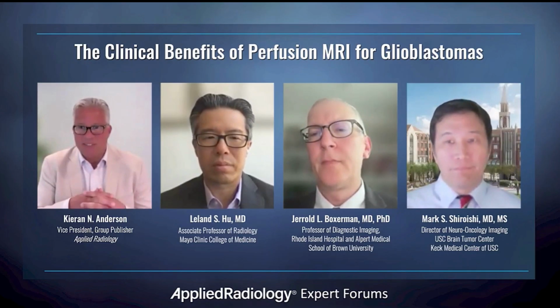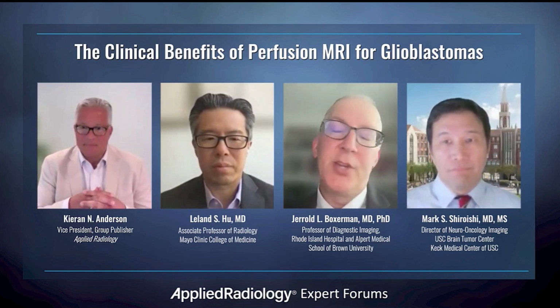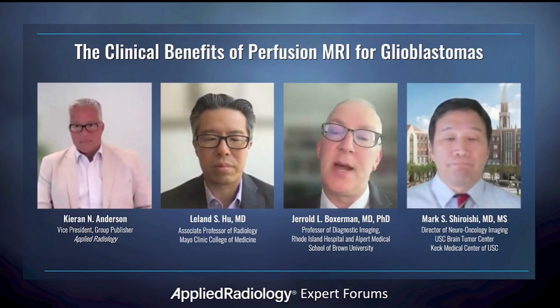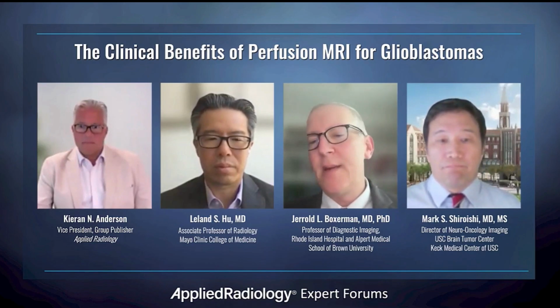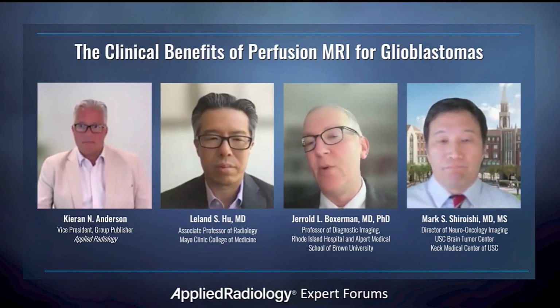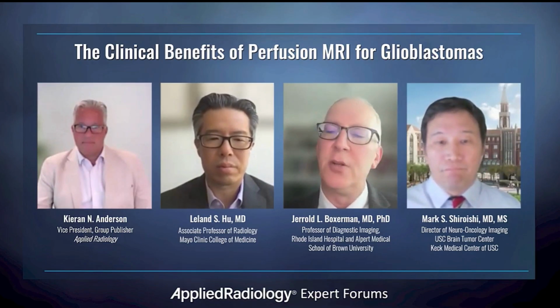Dr. Boxerman, your thoughts. Yeah, the ultimate goal here is to improve and impact patient care. And the main criteria that's currently used clinically, for instance, for response assessment in high-grade gliomas is the RANO criteria. And I'd like to see ultimately DSC MRI mature enough to be accepted and incorporated into RANO. That would be really the ultimate testament of its accepted clinical utility.